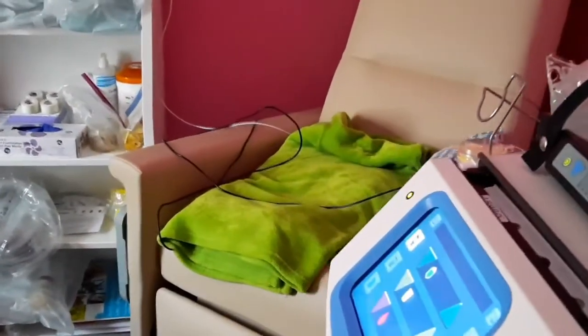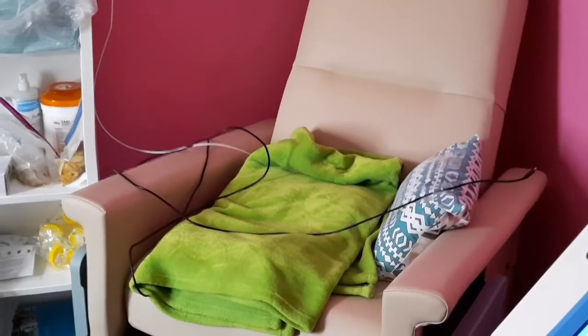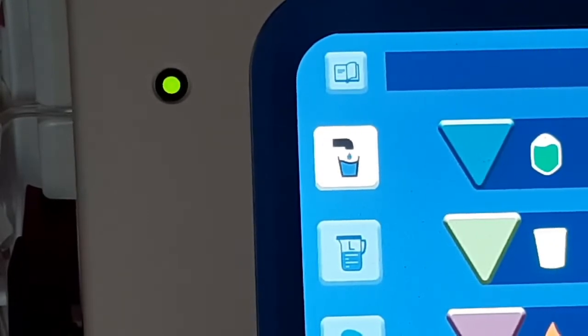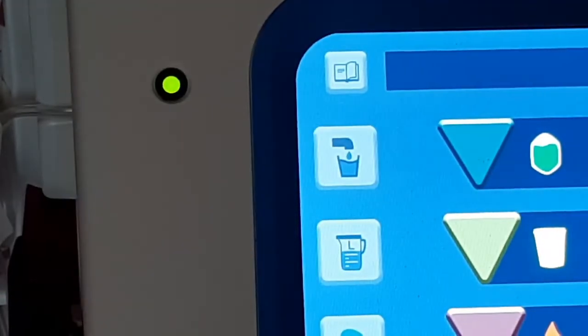Guess what? Now we get to hit the add fluid button on the cycler. Okay, you see that little faucet? The only button that is lit up, that drop of water going into that glass little faucet, that's your add fluid button. You want to go ahead and hit that, and the machine will start removing air through the lines, and it gives you a 23 minute timer, because that's how long it's going to take to do the systems check and move air through the lines. I want to see if you can see any of that happening.